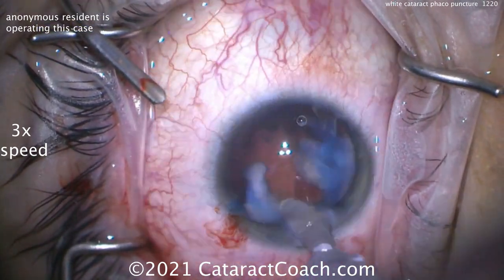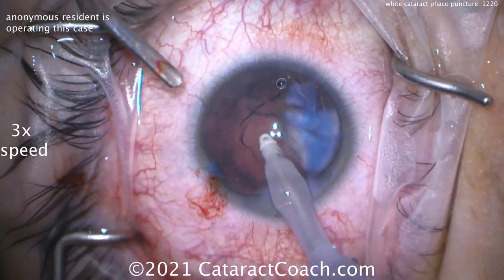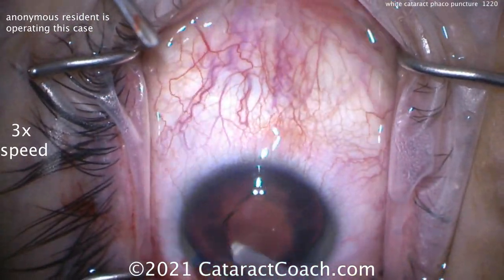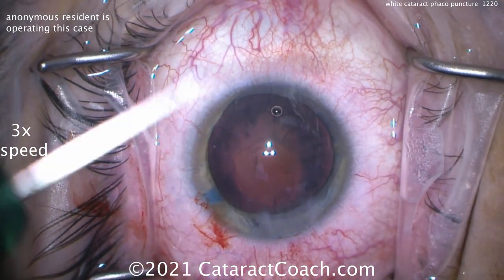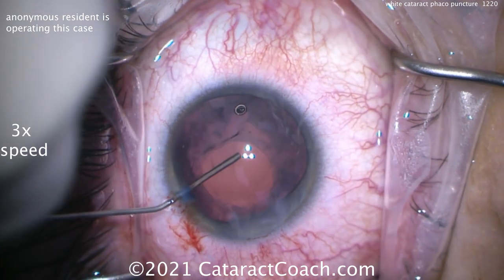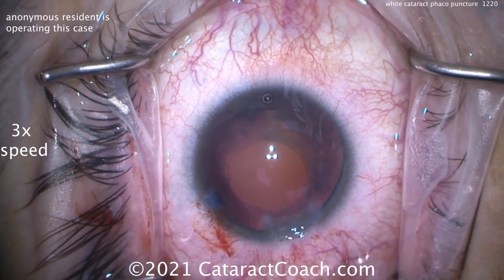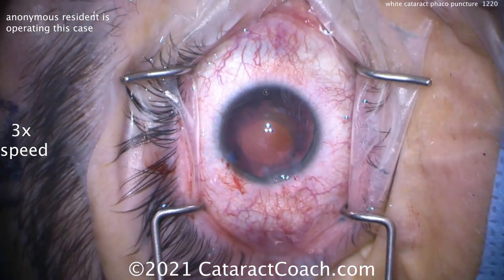Taking out the last bit of material here, just taking your time. This is not too difficult to remove. Now you're wondering what we're going to do with that smaller eccentric rhexis — well, we'll fix that up. We can enlarge that rhexis, but let's do it after we put the lens in the eye, because that's a big enough opening to put the lens in there. So fill up the capsular bag with viscoelastic, and here comes the lens — a single piece acrylic lens.